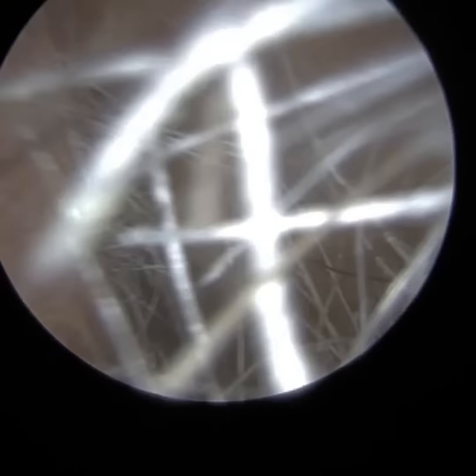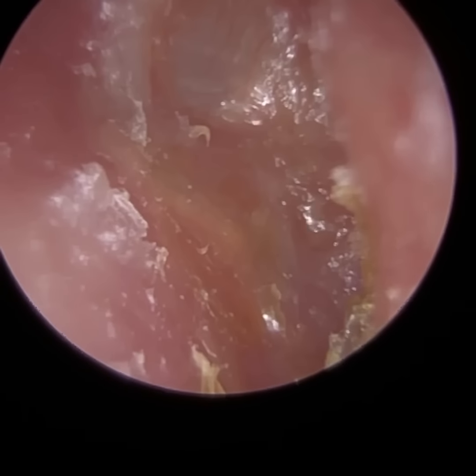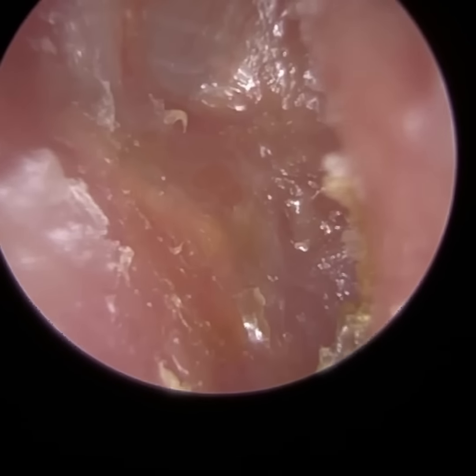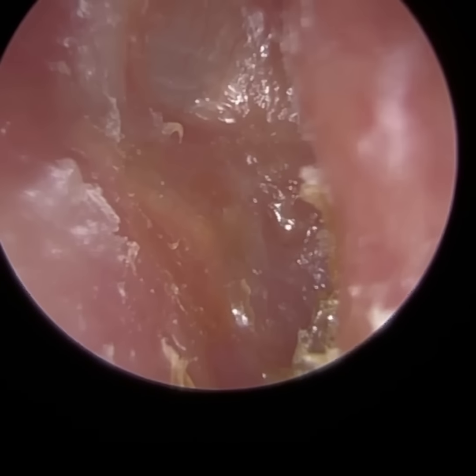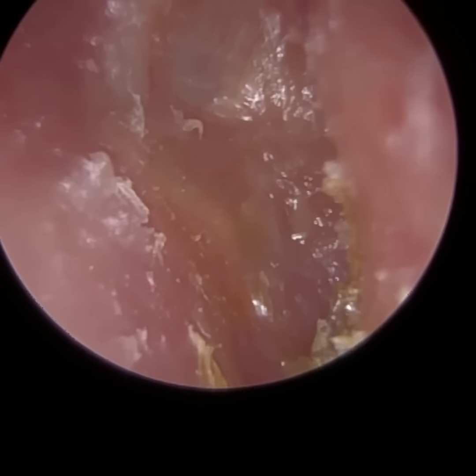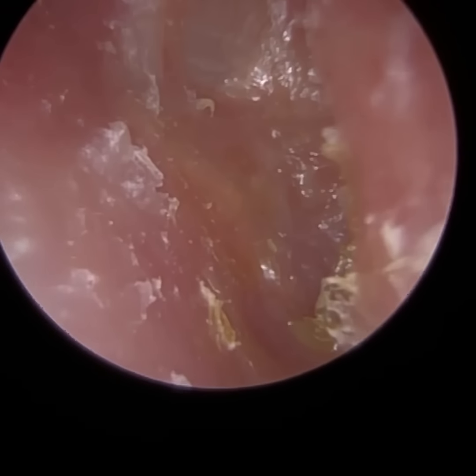Now, you'll see anteriorly, so to the front part of the eardrum, you can see it pulsating there. At first, I was wondering, is this an active perforation? But I don't believe that is. In fact, I did a pressure test to confirm it. The eardrum is made up of 3 membranes. The outermost membrane, as I mentioned before, is the same skin that lines the ear canal, and that skin dies and sheds as epithelial skin.